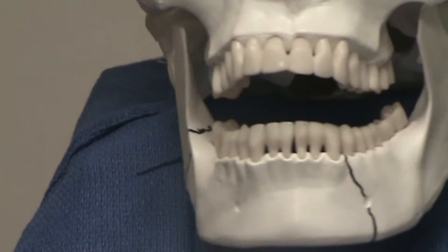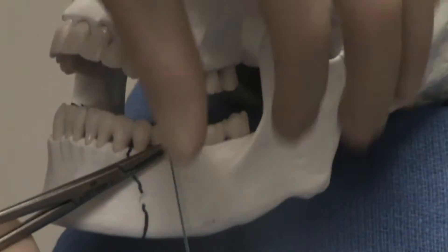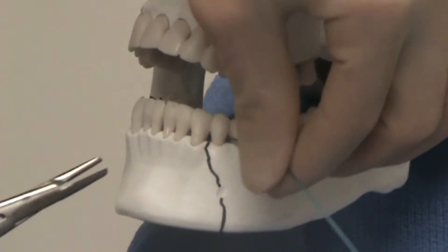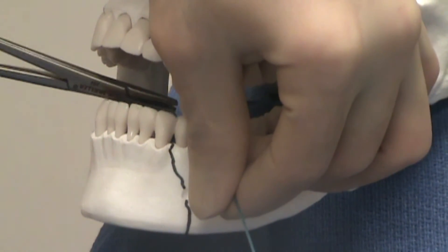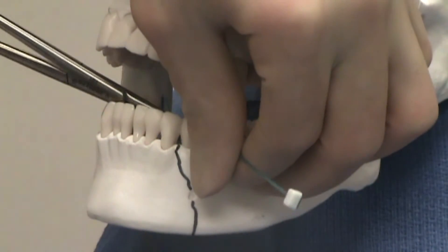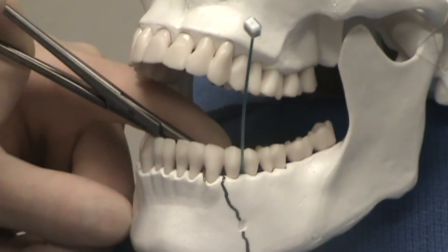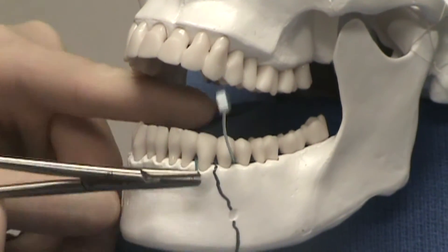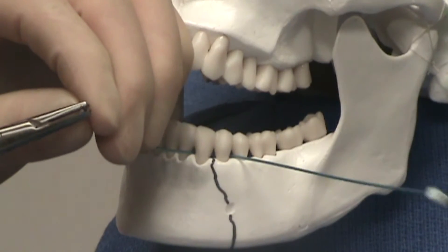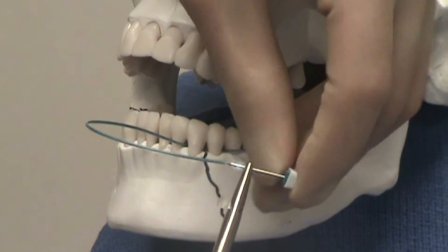Here we use a plastic skull to model how these devices are applied to a mandible that is fractured in the left parasymphyseal and the right angle regions. A device can be applied in a tension band or bridle wire style fashion as shown in the video. The device can stabilize the fracture by securing two adjacent teeth to each other near the fracture.